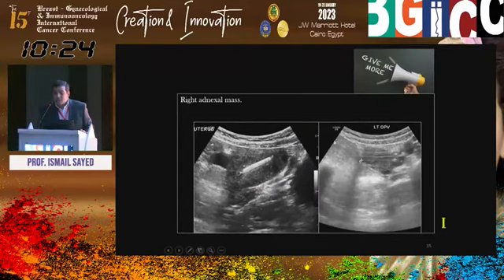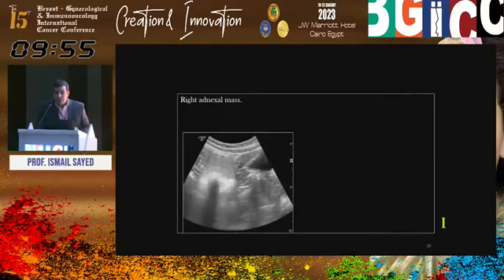Another case with the same etiology. This is the left ovary. I cannot see the right ovary. The patient has chronic pelvic pain, but mild, no fever. I cannot see the right ovary, but do you see this increased echogenicity in the pelvis? This increased echogenicity may be echogenic fat, or maybe something else. Is it localized now? Another dermoid with fluid leveling.